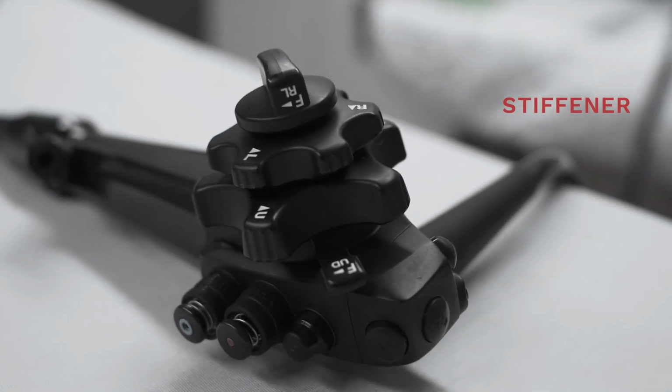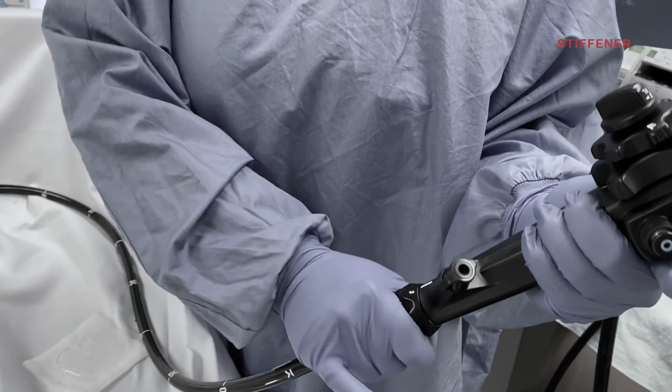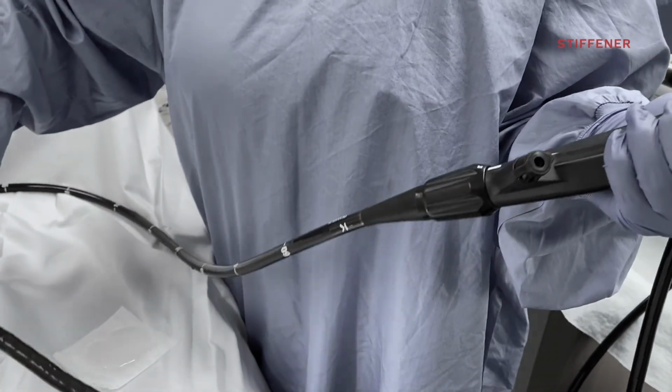Most scopes have the ability to change tension and flexibility in the scope. Variable stiffness can be quite beneficial in some cases. The procedure is ideally begun with the stiffener at the lowest setting. Once the sigmoid has been negotiated, with the scope straightened, it can be useful to increase the stiffness to avoid further loop formation as the scope is advanced.